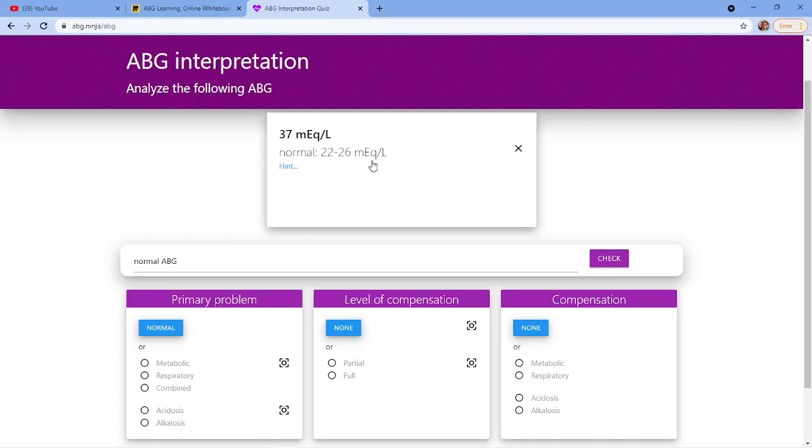And that's the thing with ABGs. People want to figure out why. We don't know why. That's not what we're asking. We just know that there's a lot of bicarb. Bicarb is a base, you know what they say nowadays. So lots of bicarb. So we have lots of basic bicarb, we have a little bit of acidic carbon dioxide, and we got a basic pH.